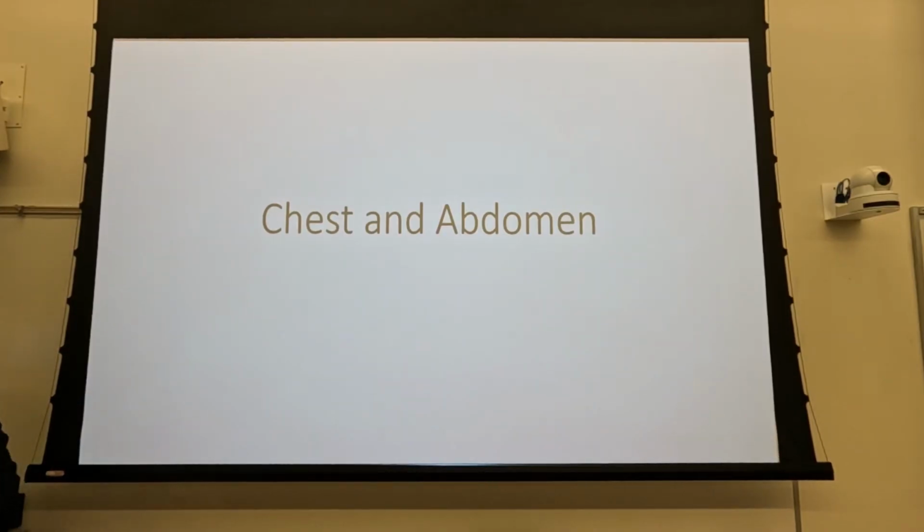We're going to talk about the patient's rotated, how to determine which way to rotate the patient, because the last thing that you want to do is walk back into the room and do the exact same thing that you just did. Now, I use this illustration, it's a little bit embarrassing, but it's part of my training. I was a first semester student and this was a long time ago, right?